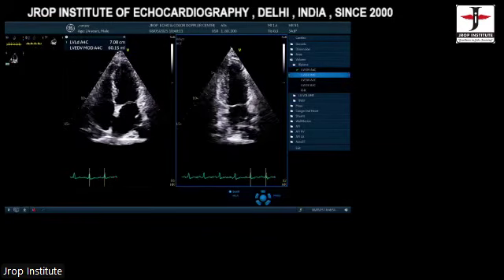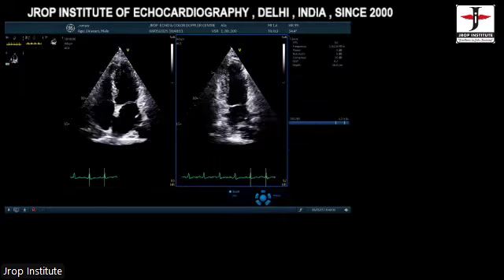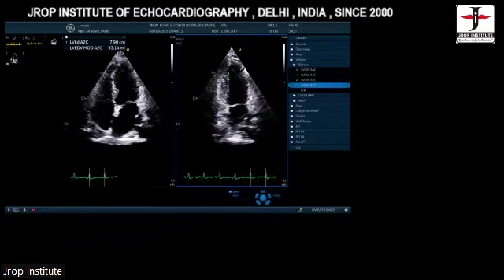Then systolic volume, scroll the probe and then you get another cursor. Then you calculate the end systolic volume. So what we get? Ejection fraction of 52%. Now we keep this in mind. Now I'm going to go to 2-chamber view. Do my 2-chamber end diastolic volumes. And systolic volumes.